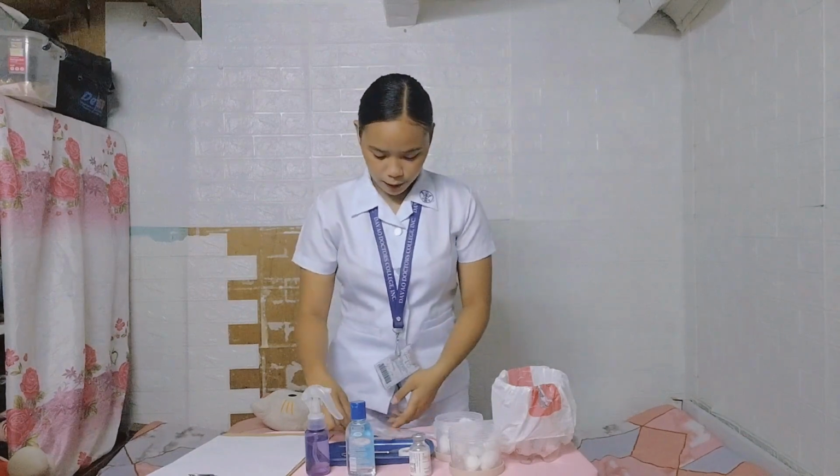Now I am going to proceed to the preparation of the medication from a vial. I have here the tuberculin syringe, which is ideal for intradermal injections. Open the package and always remember to only touch the barrel and the plunger of the syringe to avoid contaminating the needle.